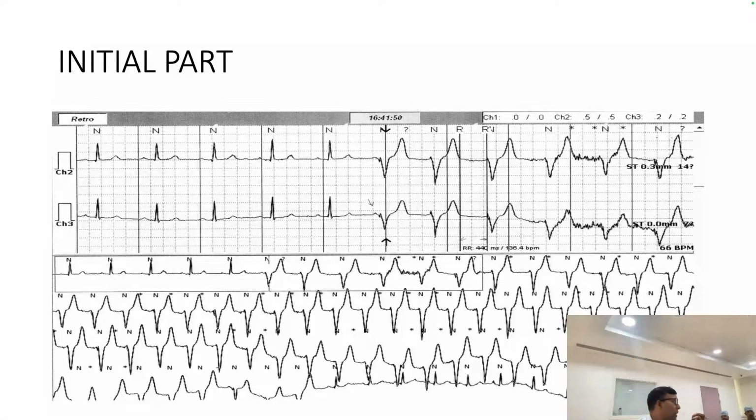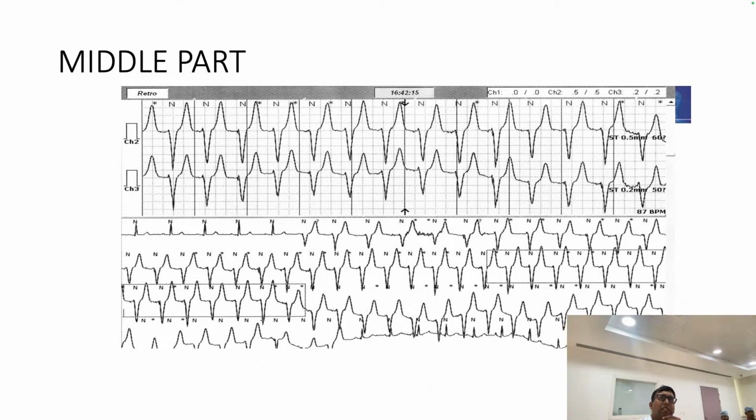Yeah, it is totally device related. The device is doing something or it is misinterpreting, either of these things. So the middle part, everything is fine. Pacing is going on, but why should it pace when its own original rate is normal? So it is trying to check something.